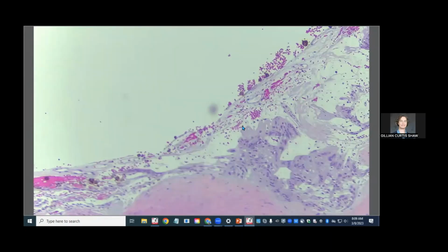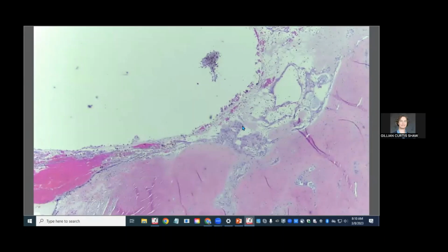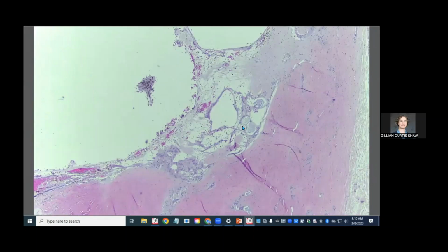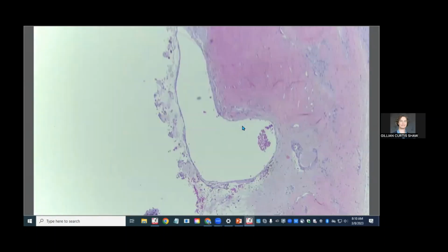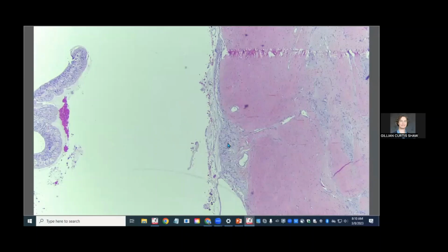So a coloboma is a congenital absence of something. And in this case, the ciliary body is absent right here. We don't have any of the ciliary body stroma, at least. This epithelium, perhaps peripheral neural retina, is on the surface, but the ciliary body itself is absent. As we follow it along, let's see what we pick up. Here's a little bit more maybe convincing retina, and here's a little bit of retina out here. This rounded end is consistent with a retinal tear.